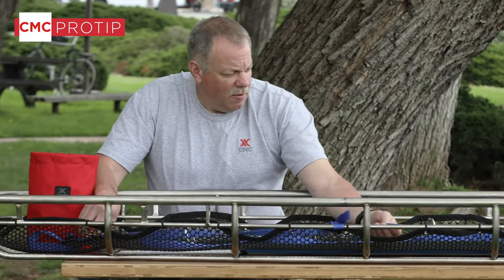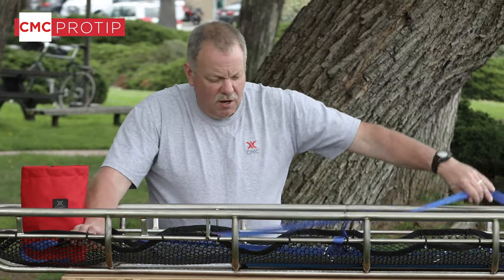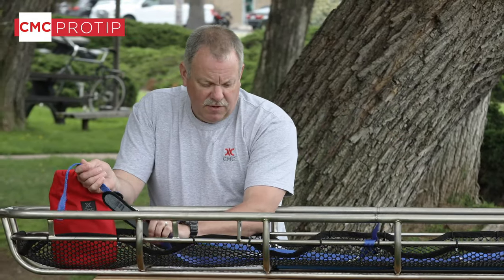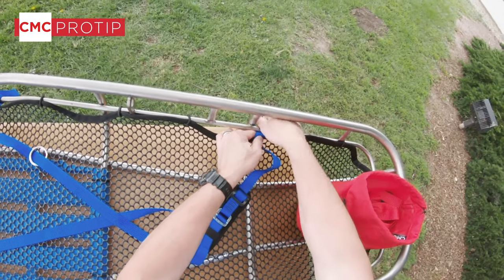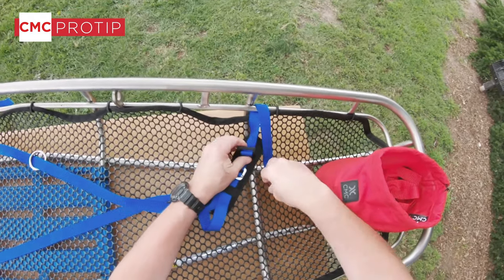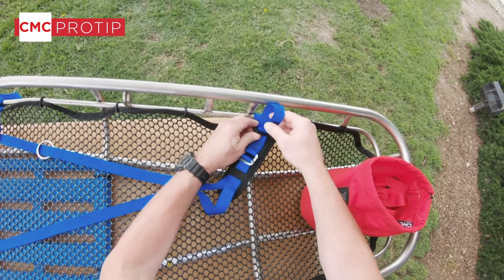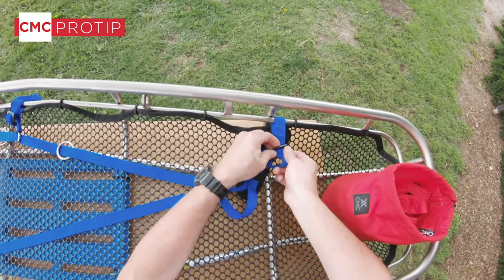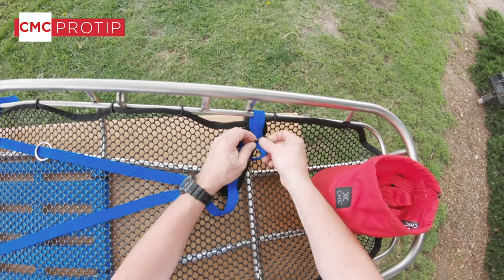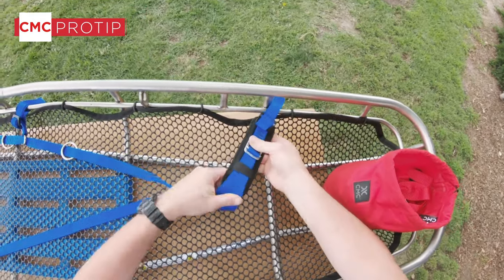When we get down to the end we want to make sure there are no twists in here, so when we tighten it up it's nice and secure on the patient. It's also more comfortable and makes it easier for the rescuer to tighten. You'll notice the Stokes is marked on the harness so if we take it off or remove the webbing for cleaning, it makes it much easier to reinstall.